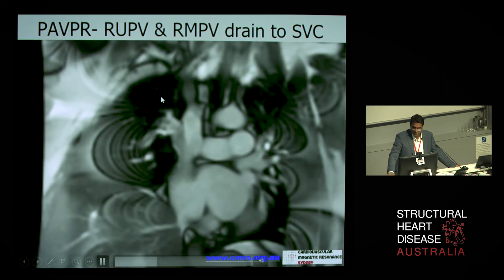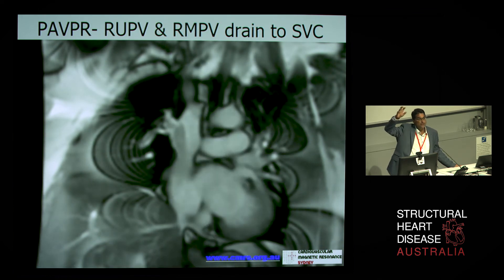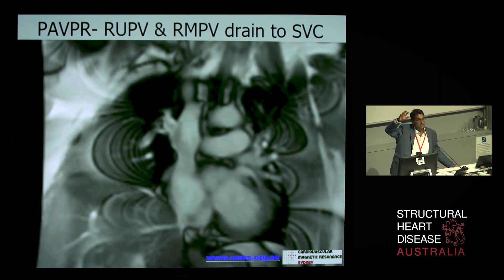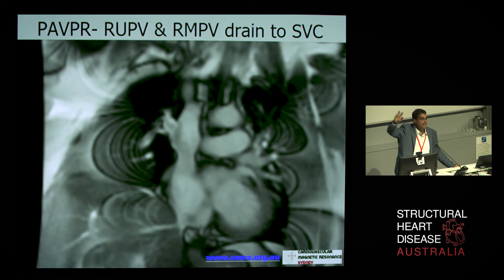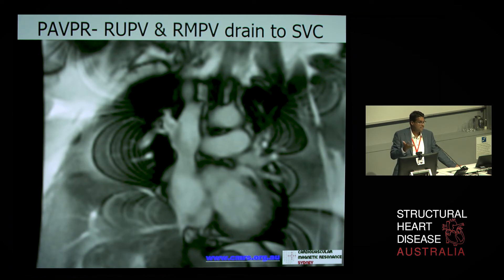What we actually find is that when we image this person, there are anomalous veins — most of the right middle and upper pulmonary veins are all coming into the SVC and explain that shunt. That's where the additional flow has come from, occurring about three centimetres above the SVC-RA junction. Really difficult to image any other way apart from this kind of cross-sectional imaging.